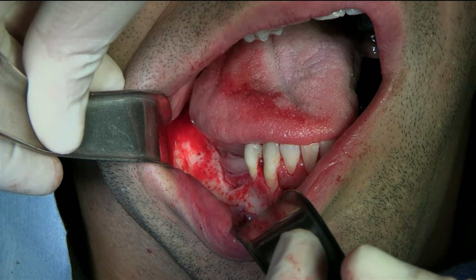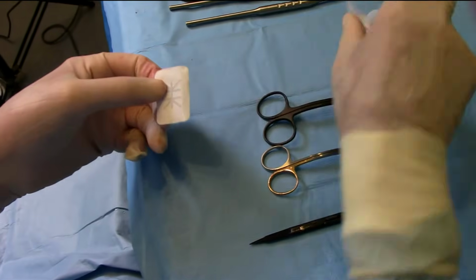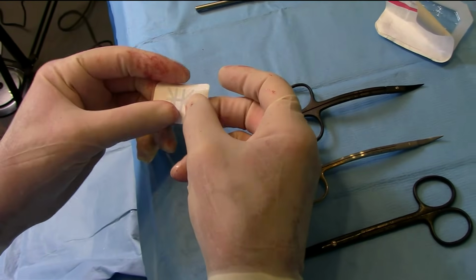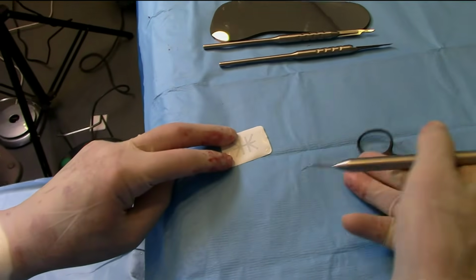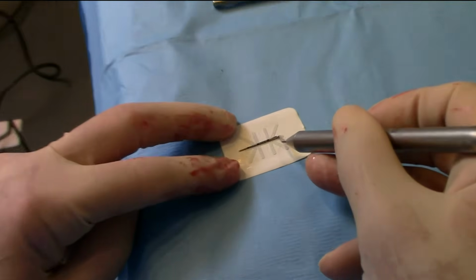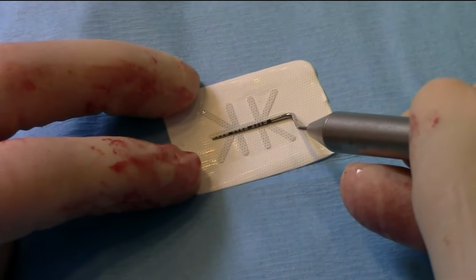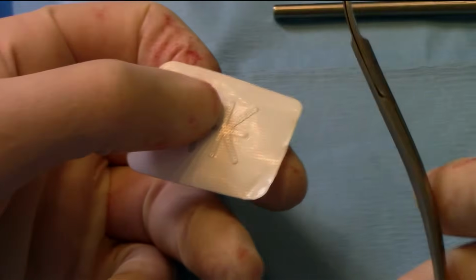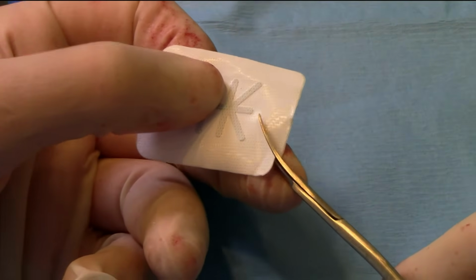This 10 screw? Yeah, do it. Do you want to do this or handpiece? Handpiece, yeah. So the spine is about 20. I don't need to take care of anything on the distal. I just need to trim the anterior. That's good. 80, 50, yeah.